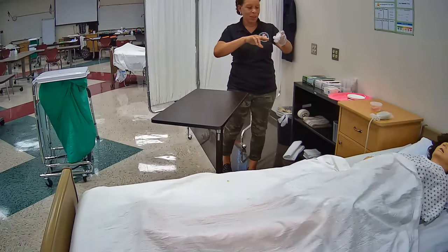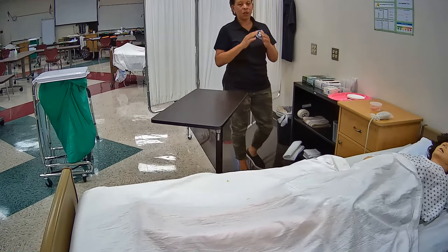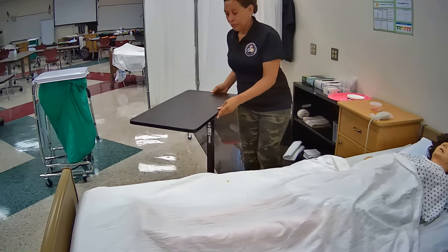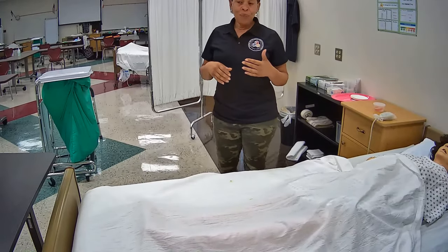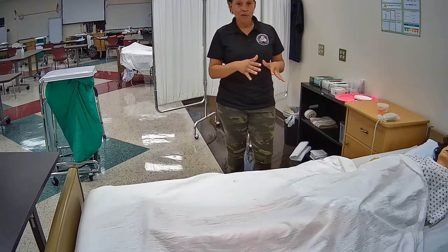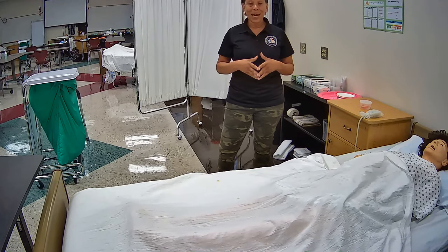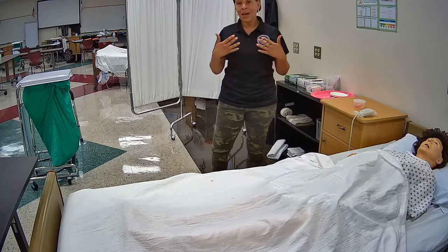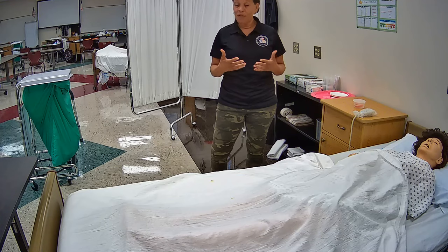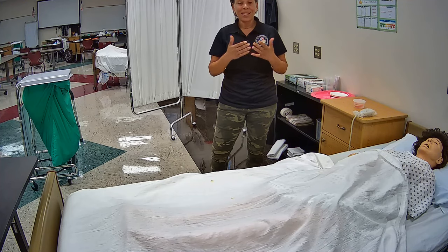I'm going to remove my gloves without contaminating myself and immediately verbalize washing hands. Now I'm just going to take a few seconds to review how I performed this skill, making sure I did not omit any steps or perform any steps incorrectly. Once I feel confident with my performance, I will then verbalize again — because you can't do it too often — washing my hands. Skill complete.